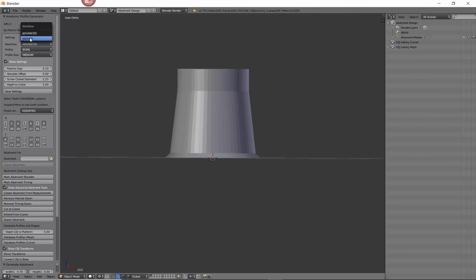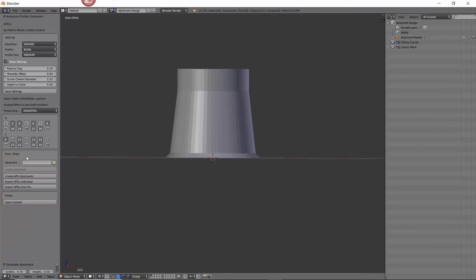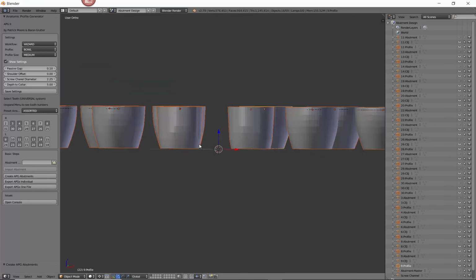I can change this back to the wizard format, make the selections I want to make, and click Create APG Abutments. Now it's going to use this generic abutment shape that I've now created, and it's going to separate these, remove this from the actual healer shape. Give it just a second. I'm on battery power on my laptop, so it might take a little bit longer, but there we go.